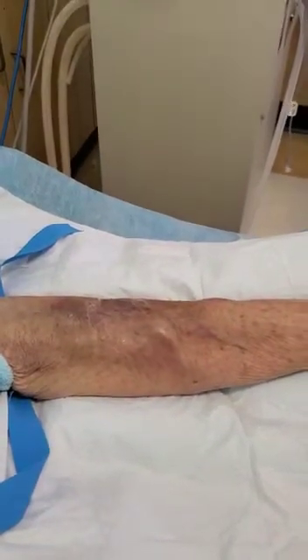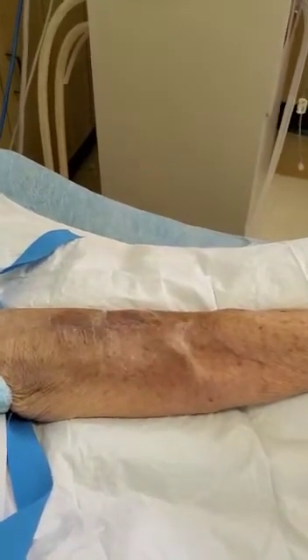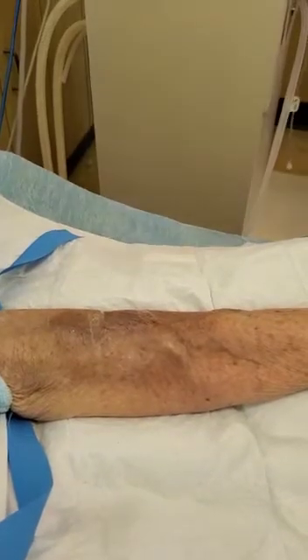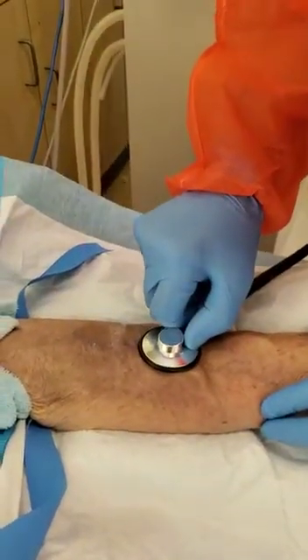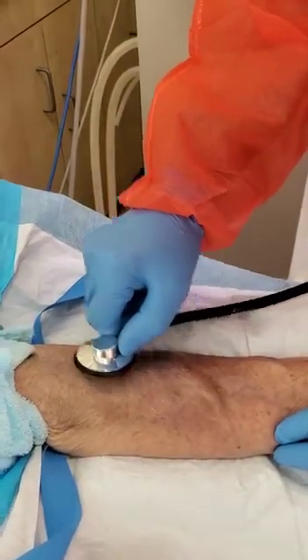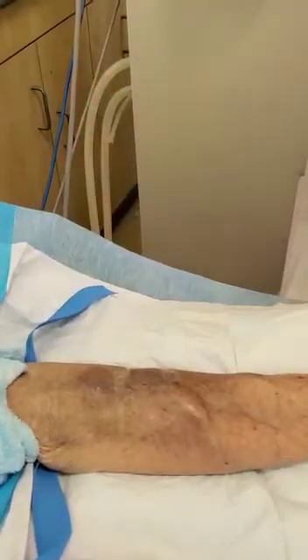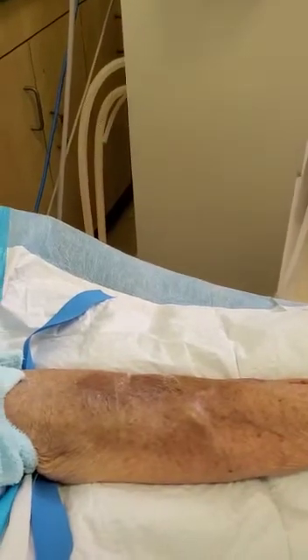This is a well-developed fistula and our technician has looked for signs of infection — the access looks clean, no signs of infection. Now he's going to listen for the bruit, placing his stethoscope along the continuum of the access and listening everywhere. He confirmed it's a go, so now he's going to feel for the thrill.